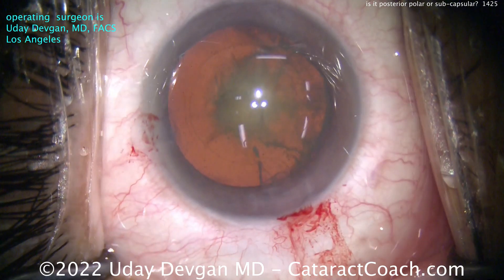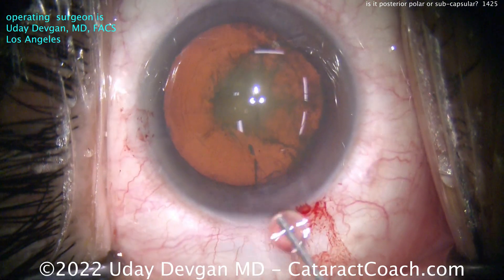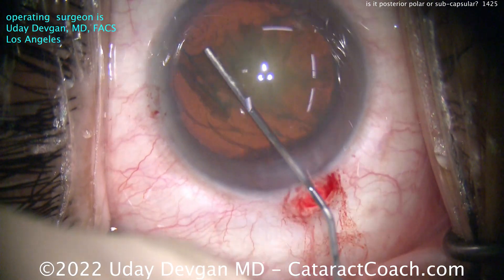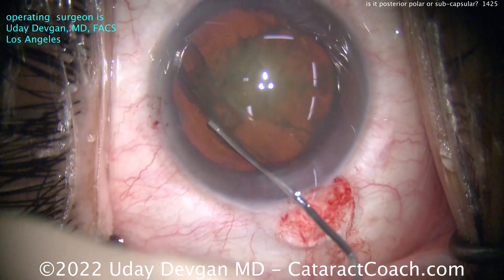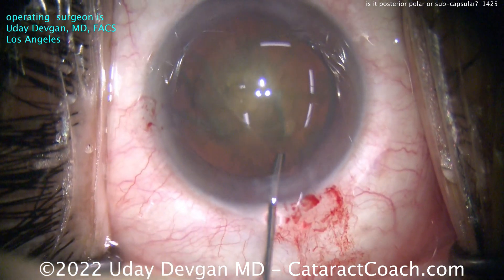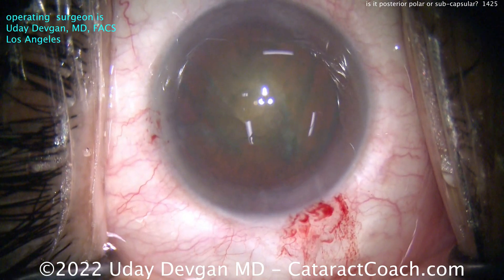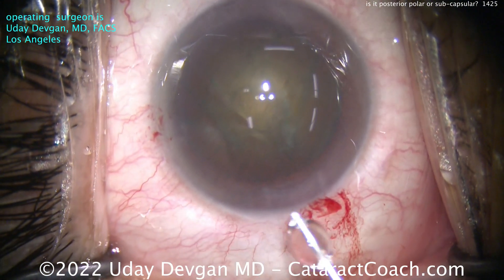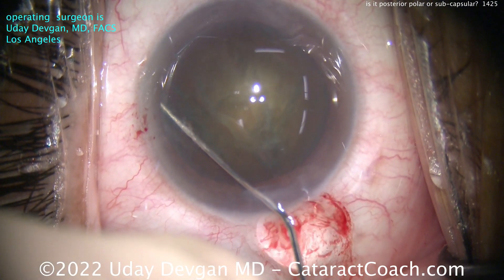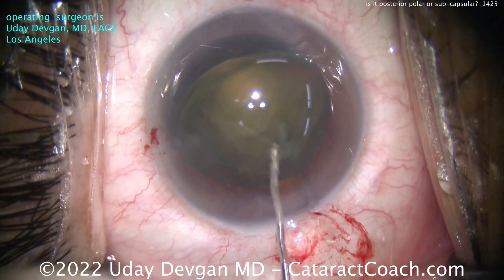Now again — what's your decision? Hydrodissection or not, yes or no? I'm just going to go for it — I'm feeling hydrodissection. I'm going for it and watching really carefully: is there any change? Does the AC slightly deepen? Is there some deepening of the posterior chamber? Is there a split of the capsule? Do I notice any instability of the lens? So far so good — kind of seems okay.